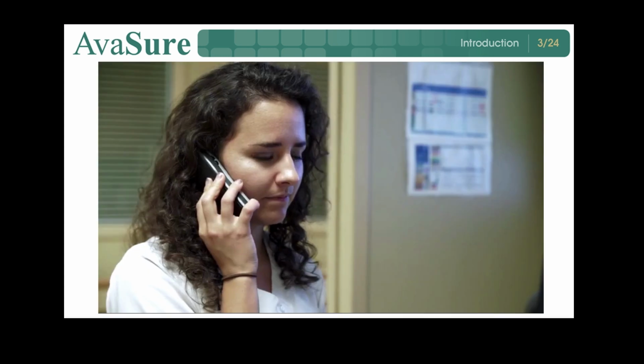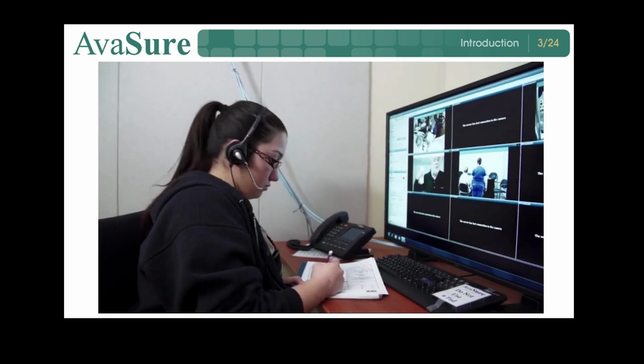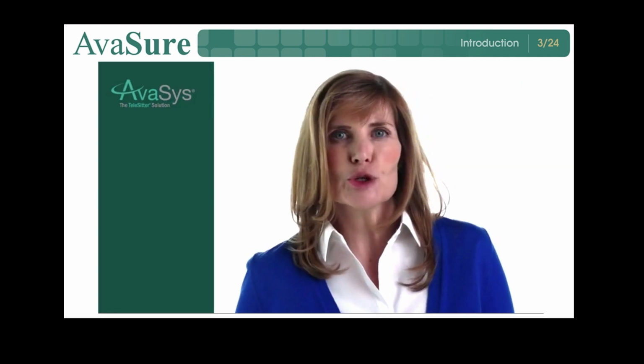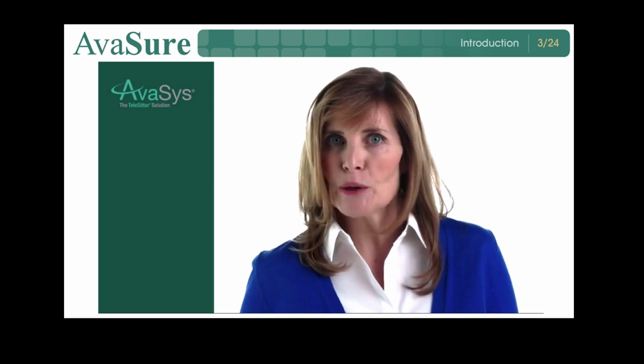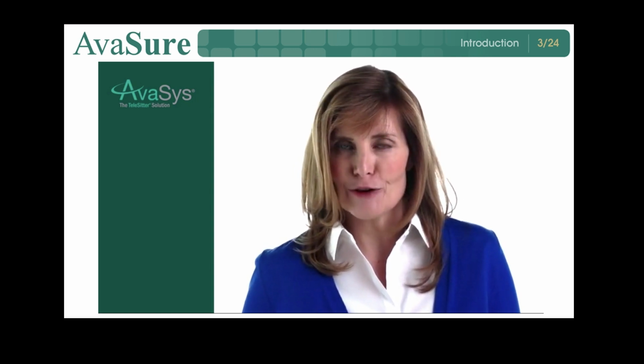A process will be implemented in your facility to ensure that each change of shift, the new caregiver assignments are quickly communicated to the central monitoring station, so the observer has the needed contact information. This information is recorded directly into the software for quick reference. It is updated each shift with new contact information.